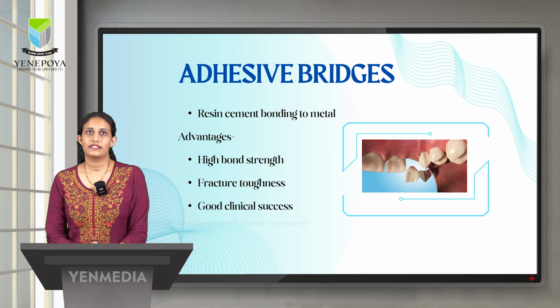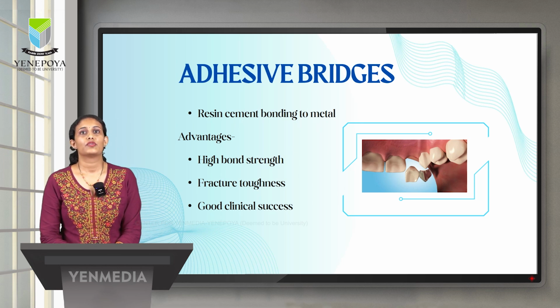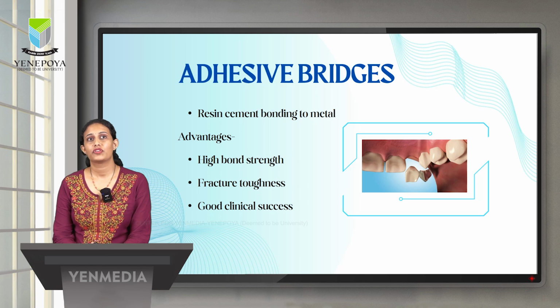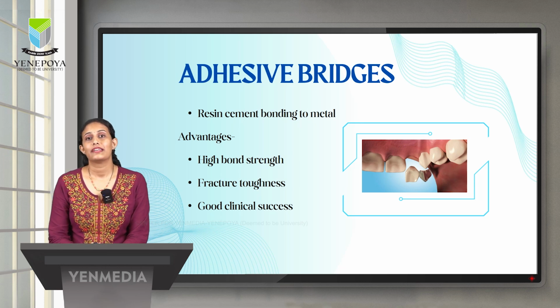Now moving on to the adhesive bridges, the resin cement is bonded to the metal surface. The advantages of the adhesive bridges are that it has high bond strength, the fracture toughness is high, and there is good clinical success.